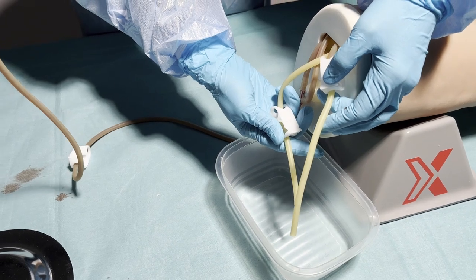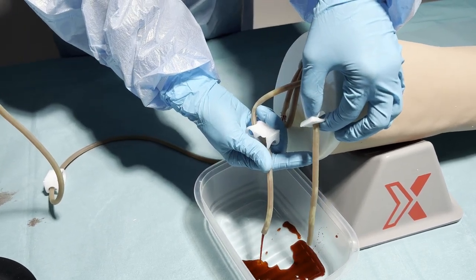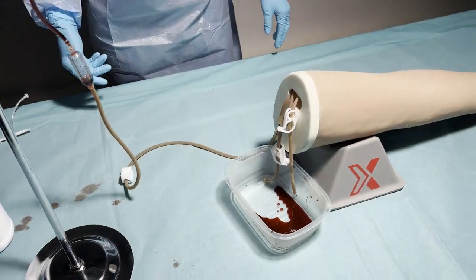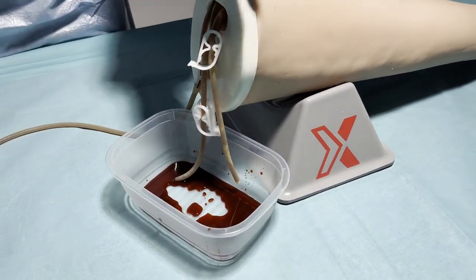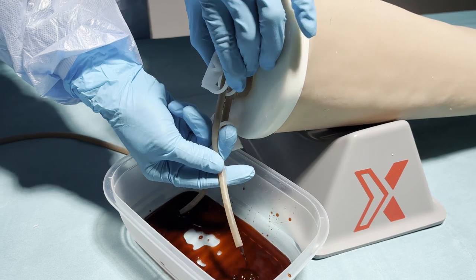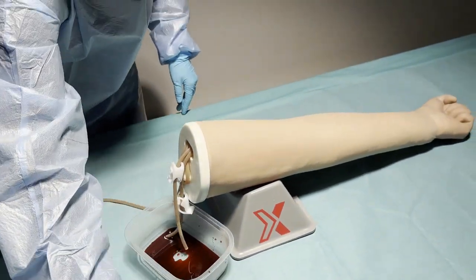When the blood comes from the open tubes, you can close the clip. Then you know that the IV arm is filled with blood. And when you notice that there are still some bubbles in the veins, you can open the clip again to make sure that all the bubbles are out. Then you can close the clip again. Now the IV arm has blood.